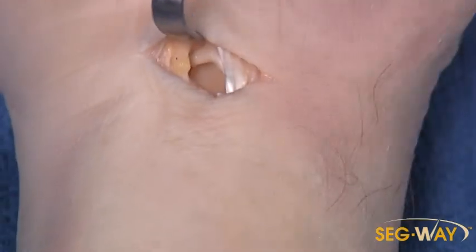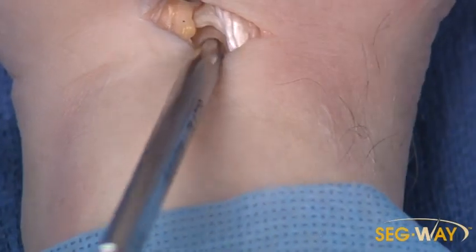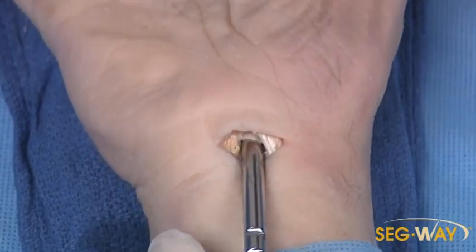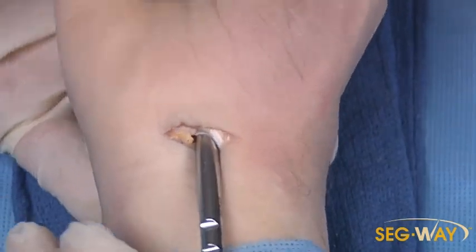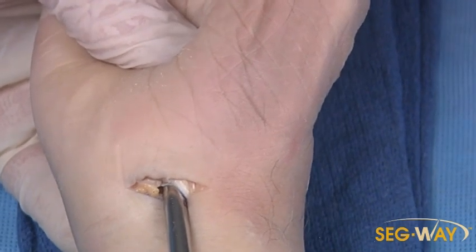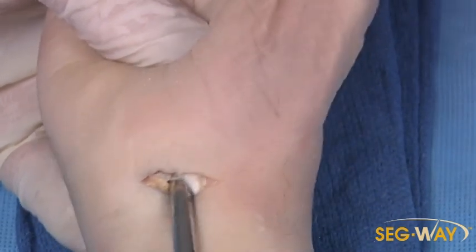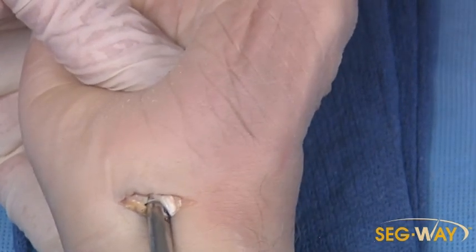Next step, we're going to use the elevator, always lifting on the skin to lift up the edge of the ligament. As this elevator passes under, you elevate the hand and you can feel it on the tip of your thumb right to the edge. You can also pull it against the hamate to confirm that you're in the carpal canal and not in Guyon's canal.